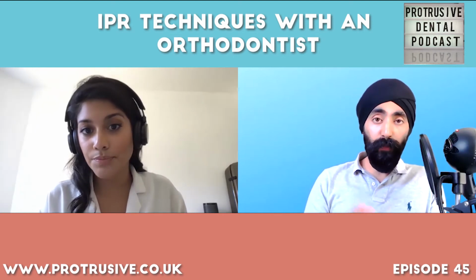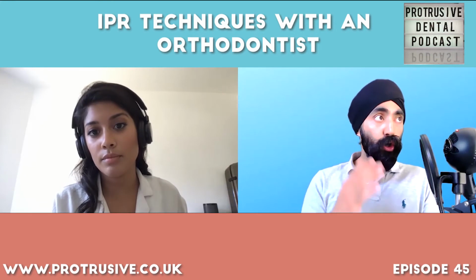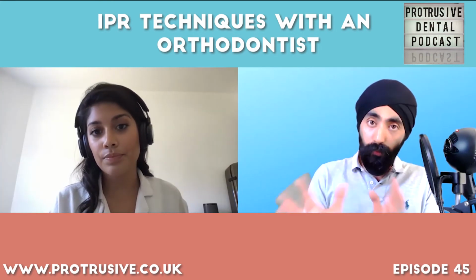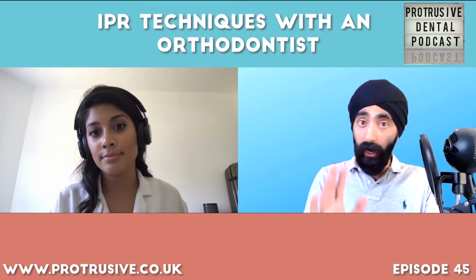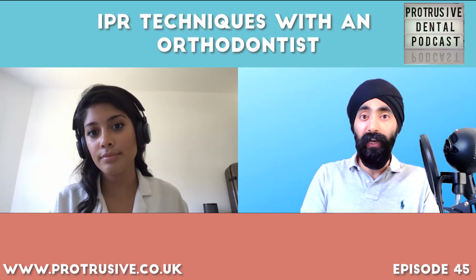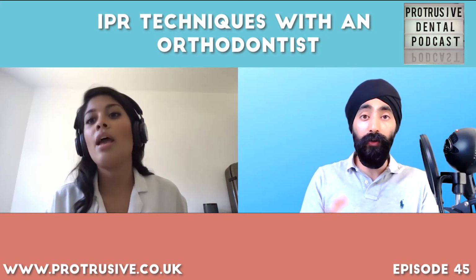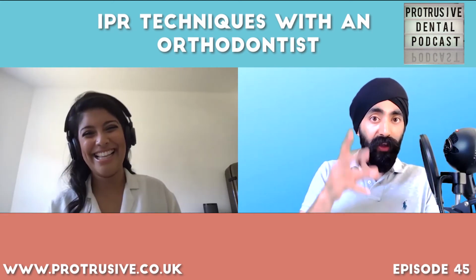I'm happy and I respect that, because that's the beauty of dentistry. Everyone's got different opinions and different ways to do it. So you're in the camp that you like to do it sequentially. I am quite case selective. Some cases I'll do it sequentially. Other cases, I have to admit, if I've got a beautiful straight contact, then I may be happy to do a bit more. But I see your point about them looking like tombstones. I think in clear aligners, you get away with it more than in fixed appliances.